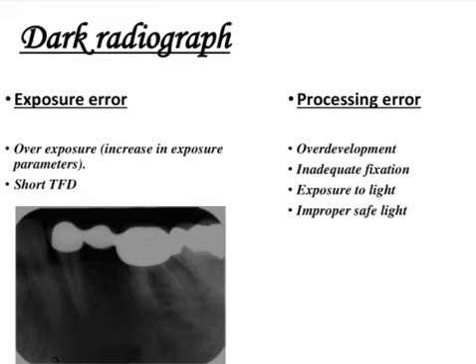You can expose the film with any object or tooth, and then you switch off the white light inside the dark room. The safe light, the red one, will be on, which is at least 4 feet away from the processing table. So you can keep the film open maximum 2 to 3 minutes. After that, the film starts fogging. Fogging means it will appear a little bit blurred once you are developing.